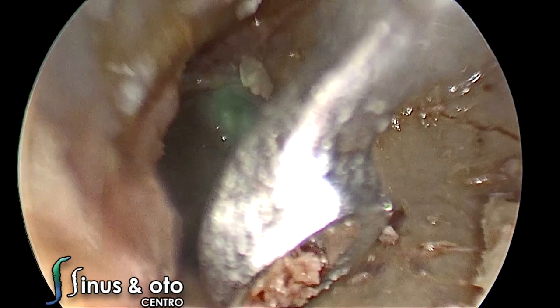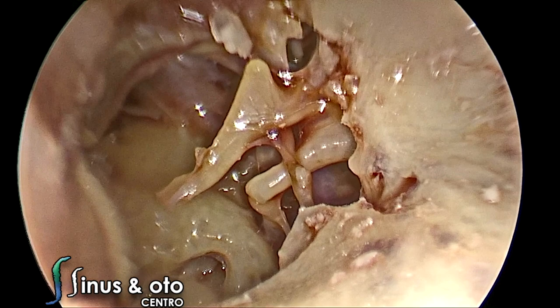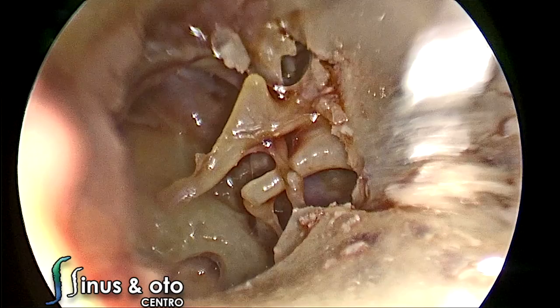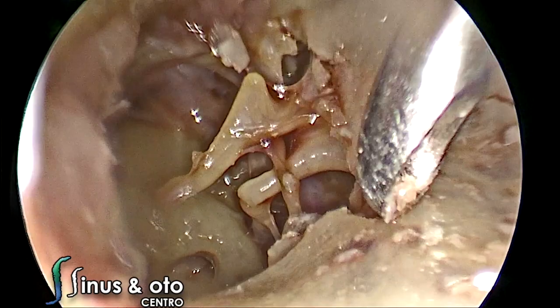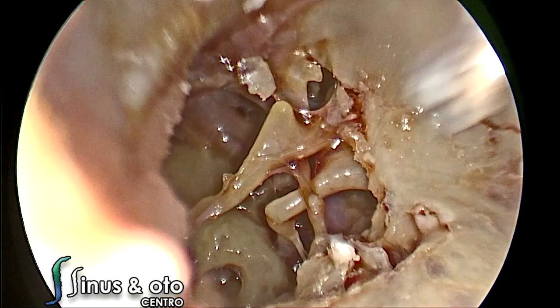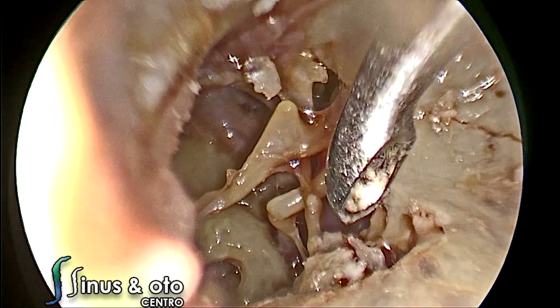We do not need to remove a lot of bone because with the wide-angle view provided by the endoscopes, you can already see a lot of the space and anatomy you want to see in the middle ear. We are here removing bone, trying to preserve the chorda tympani nerve, and removing as much bone as needed in order to see the middle ear better, especially the retrotympanic space.